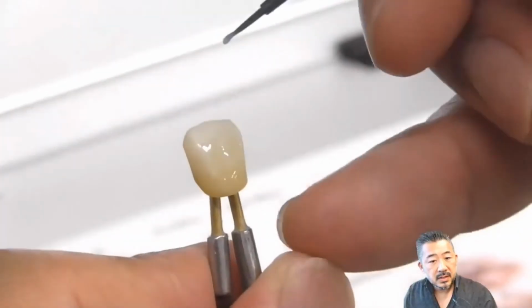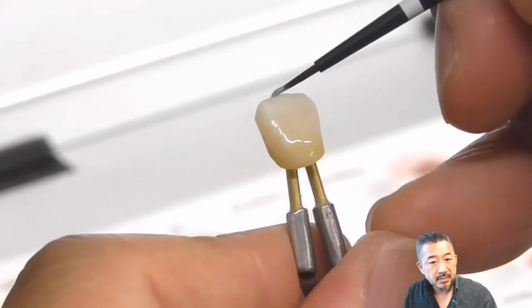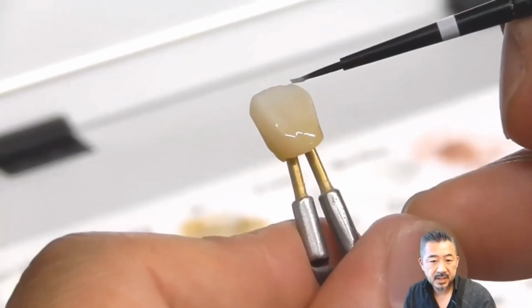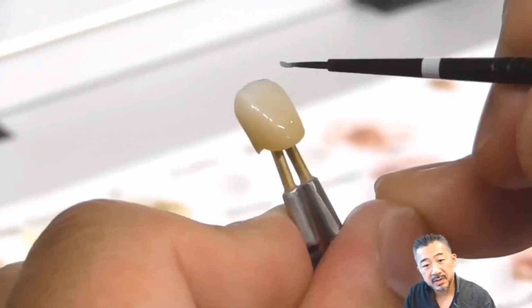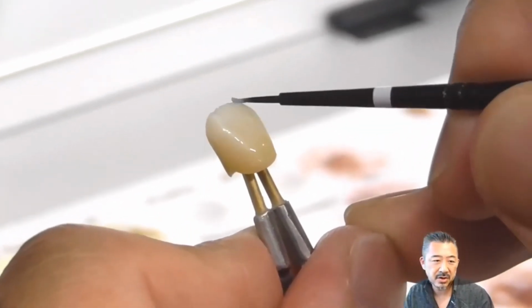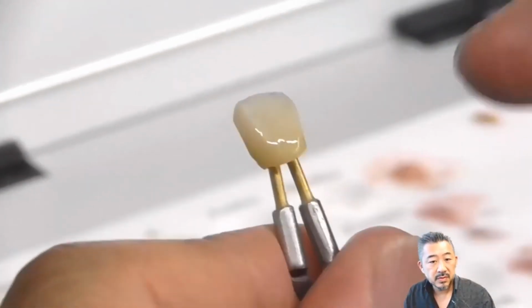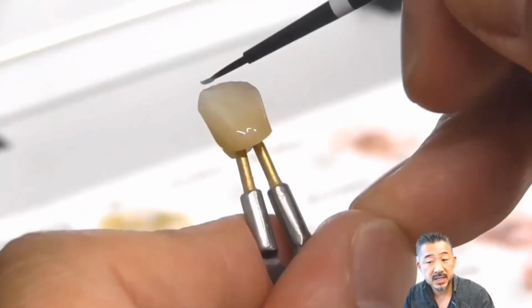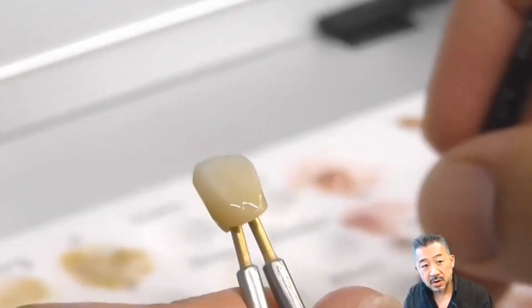And the incisor, make the incisor more transparent than the shade tab. This is aimed at the visual effect that it looks more transparent than the real one. So with a fine brush, carefully apply the blue paste from the inside of the edge to the corner.